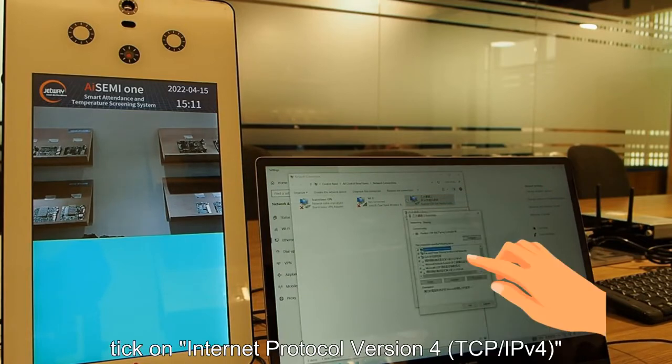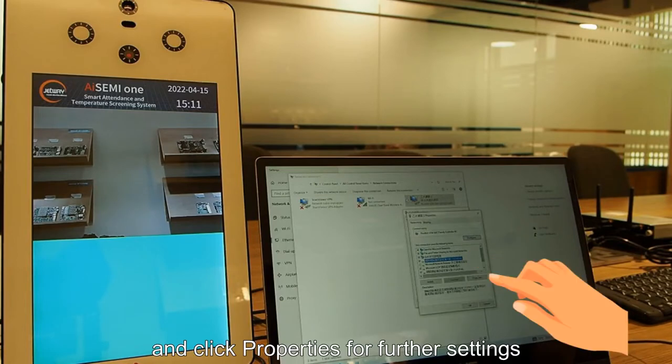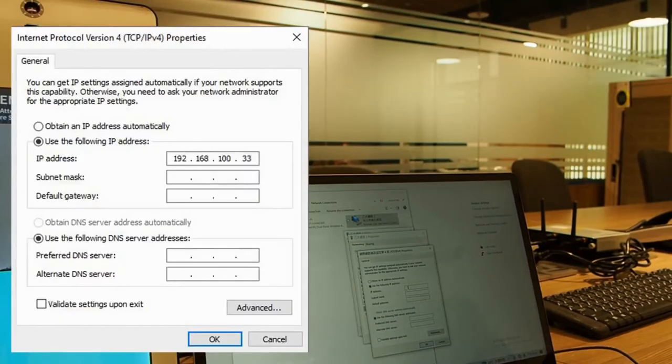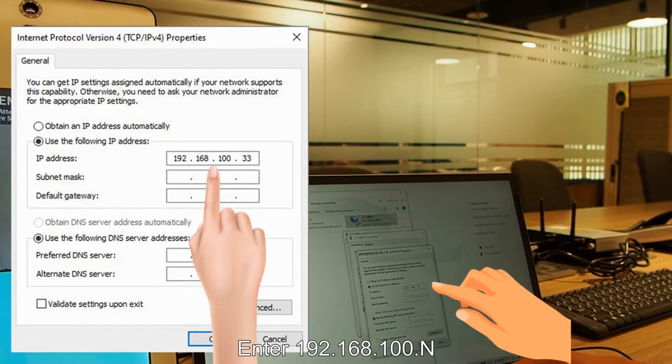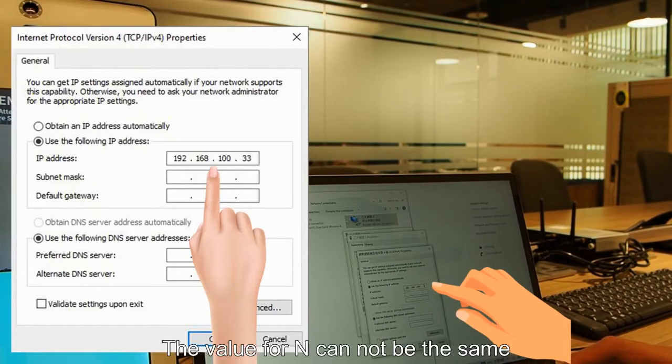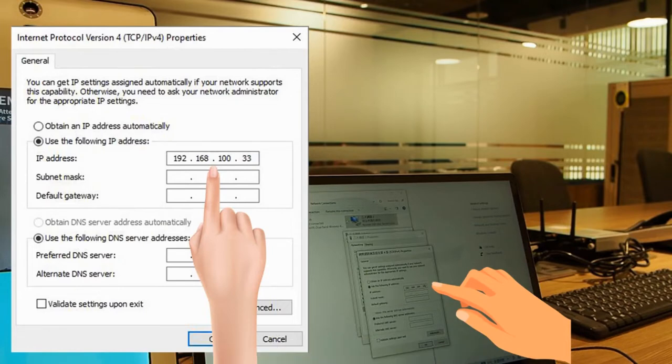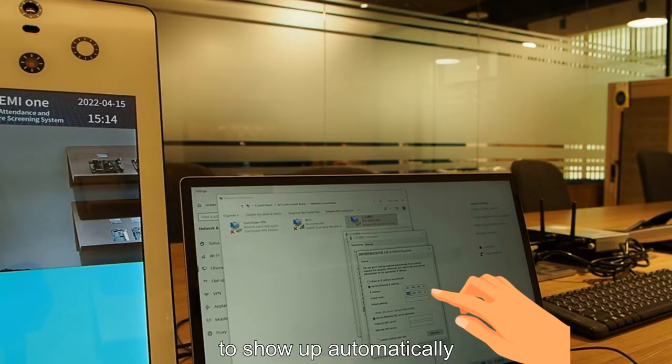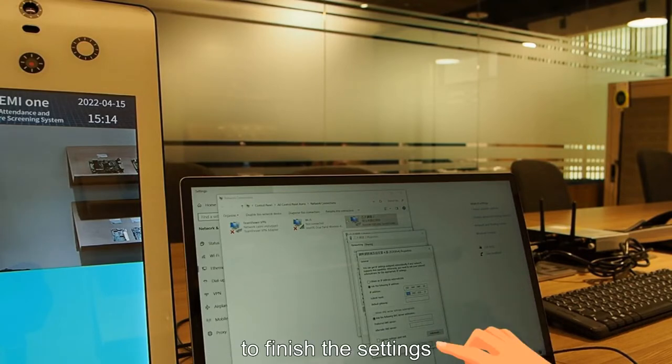Select Ethernet and click on properties. Tap on internet protocol version 4 and click properties for further settings. Enter 192.168.100.n and the value for n cannot be the same as those from i7i OneBox. Then enter tab for a subnet mask to show up automatically and click OK to finish the settings.